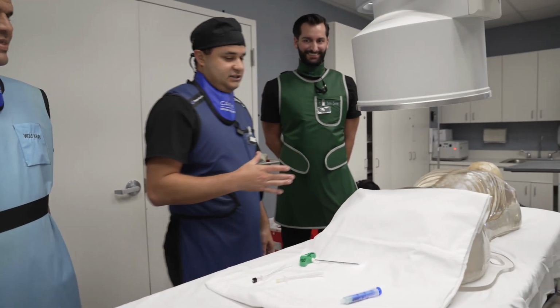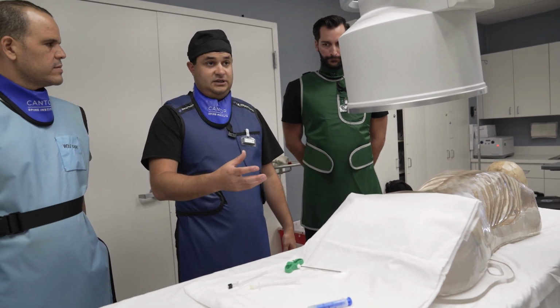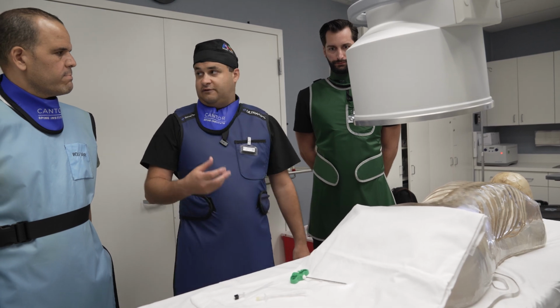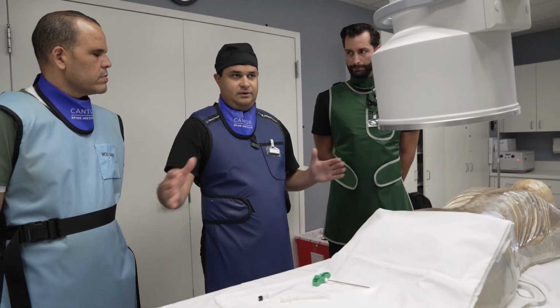So transforaminal injection, there's a few reasons to do those over interlaminar. One is we want to be very selective. So the surgeon comes to you and says, hey, I think this patient has an L4-5 or an L5 radiculopathy, right? So we're going to do an L5-S1 and just keep the medicine there, right? When we do an interlaminar, it's going to go about 3 levels up, 3 levels down.